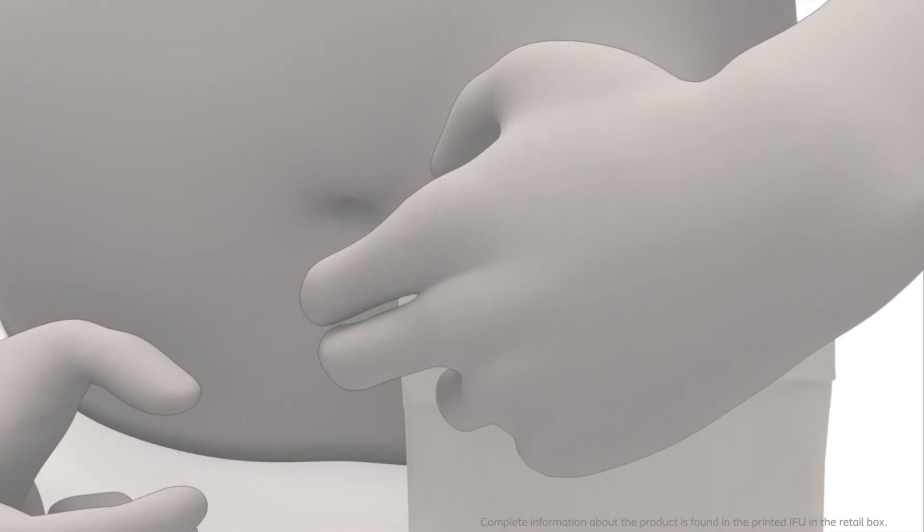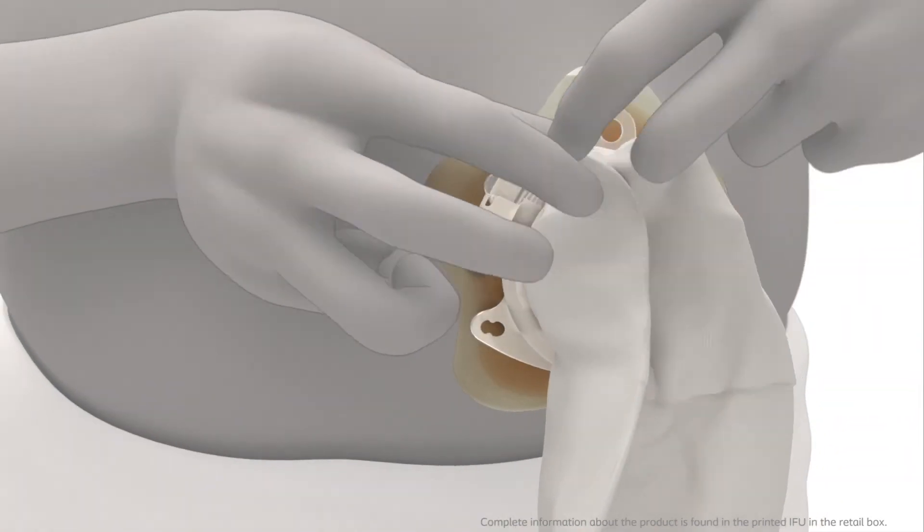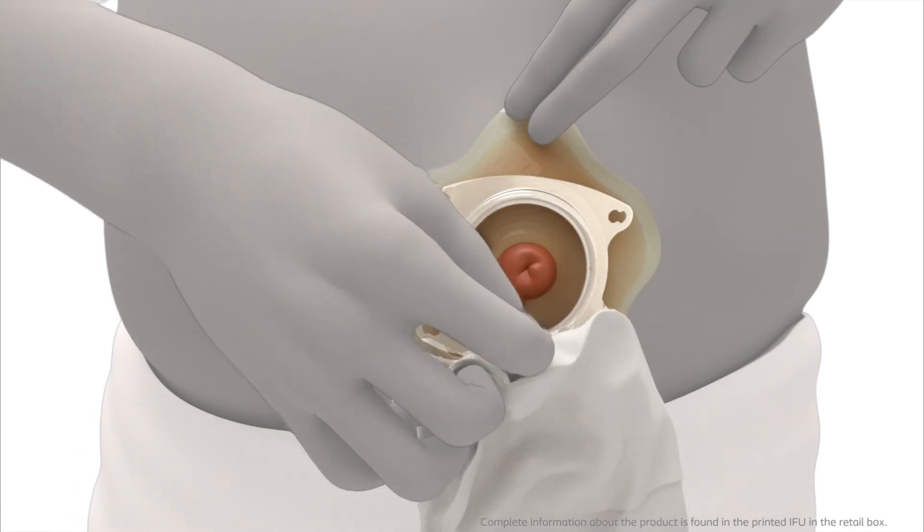Press the small turquoise tab facing your stomach with a fingertip to open the lock ring. Hold onto the bag's removal ear and remove the bag carefully, pulling the bag away from the base plate.